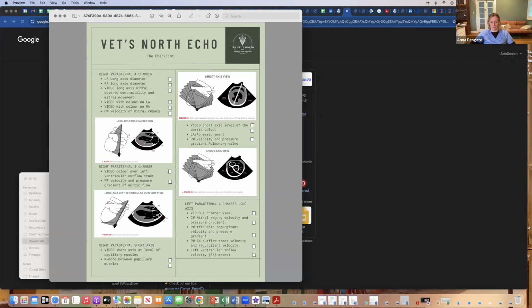I think that demonstrates that really nicely. At this level, you're going through the ventricle down the bottom here. And at this top level, where you're looking at the aorta and the left atrium, you're going through the heart base. So you've tilted the probe up from the apex right up to the heart base. And you can see that if there was, say, a myocardial mass or something weird that doesn't fall into our nice categories, in the process of moving between those views, you're going to see changes in the walls and things like that.